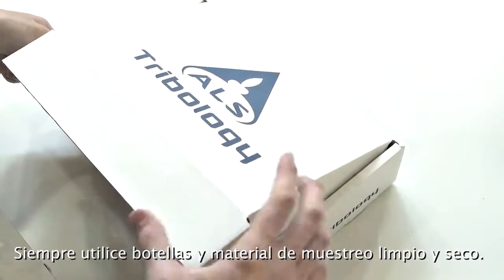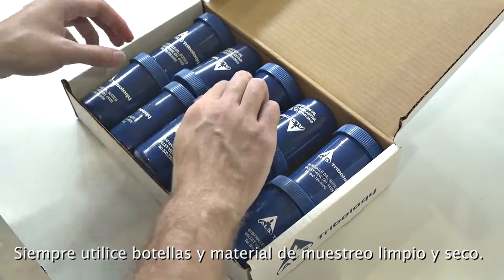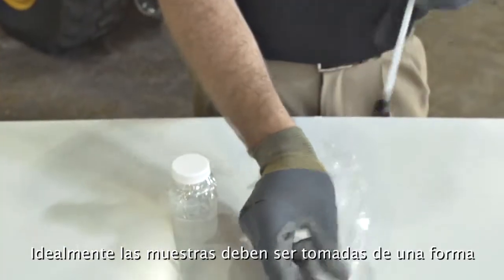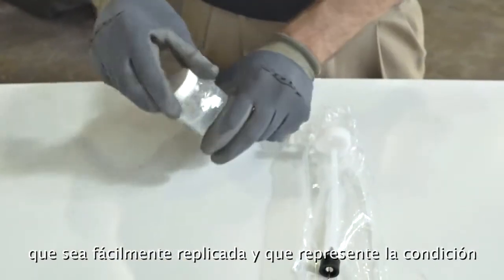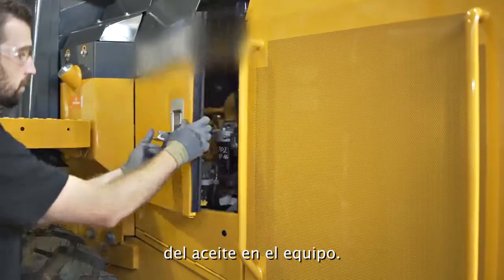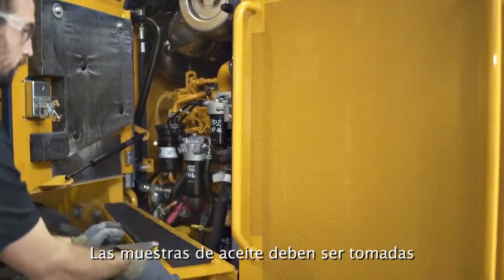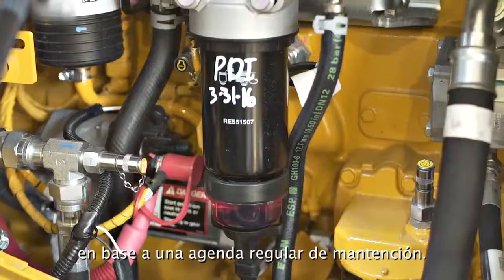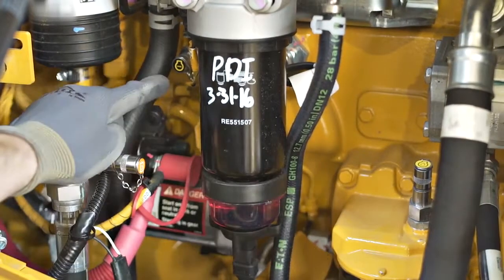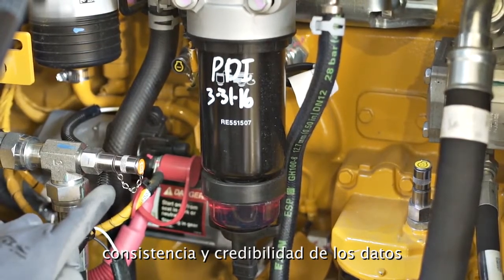Always use clean sample containers and equipment. Store sample bottles and sampling supplies so they stay clean and dry. Ideally, oil samples should be taken in a manner that is easily repeatable and effectively represents the actual condition of the oil in the equipment. Oil samples must be taken on a regular maintenance schedule. Sampling must be performed in a consistent location and manner. Good sampling procedures ensure consistency and reliability of data.